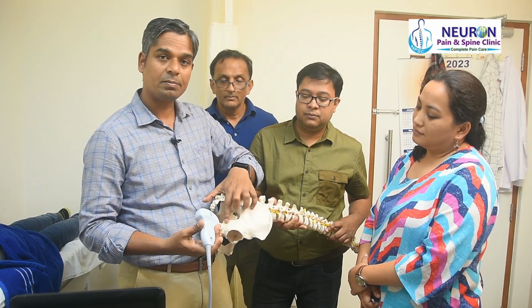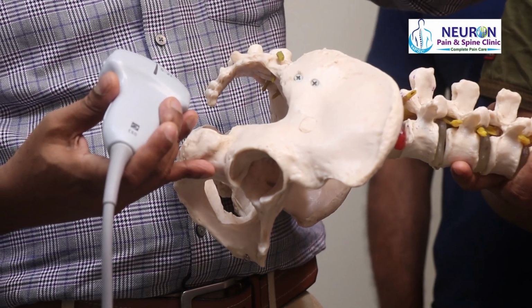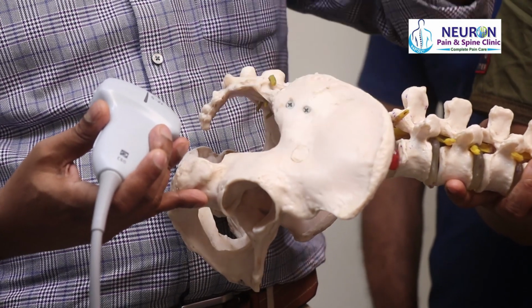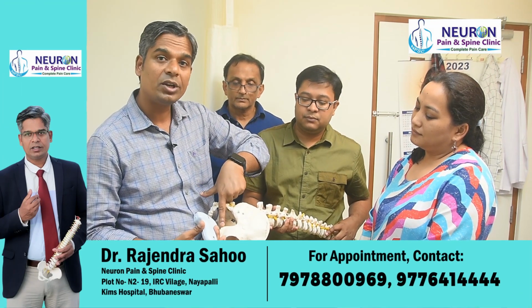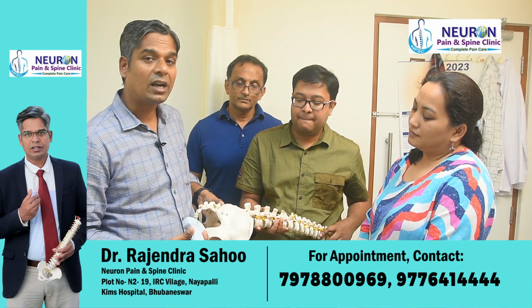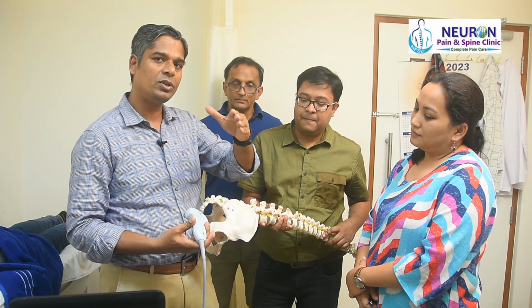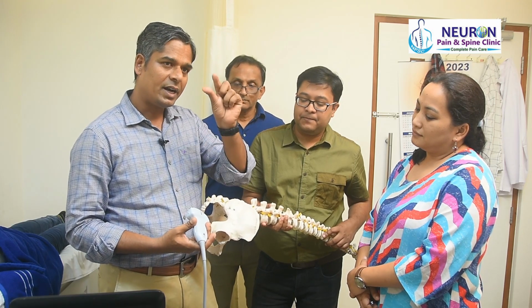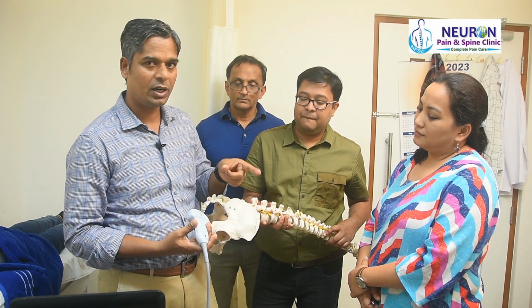So this is the ischial spine. Once I reach that ischial spine, that hyperechoic line which was like this at this level will slowly become straightened like a straight line, and there will be continuity in the hyperechoic line, that is from this ischial spine to the sacrum, that is called the sacrospinous ligament. I have to identify that. On top of that will be your sacrotuberous ligament, and in the plane between these two ligaments you will find the pudendal nerve, for a pudendal nerve block.